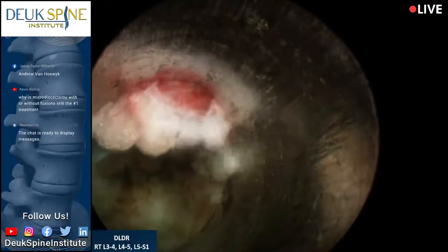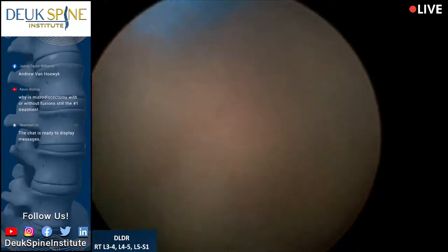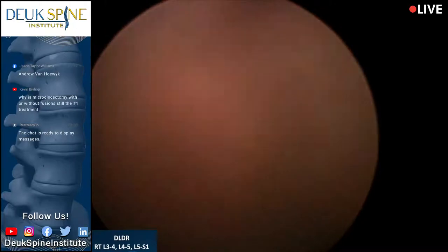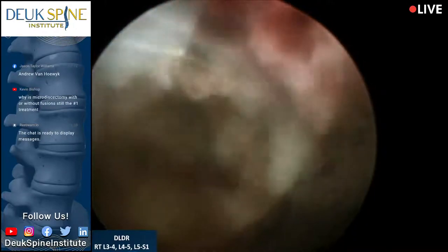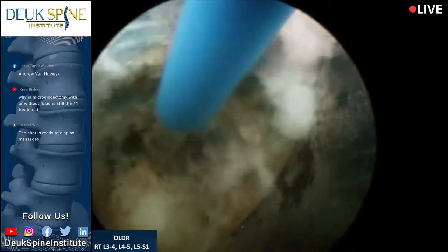People ask me, do you take out normal disc? The answer is no. We can see a difference between normal and abnormal. And we only take out the abnormal stuff.